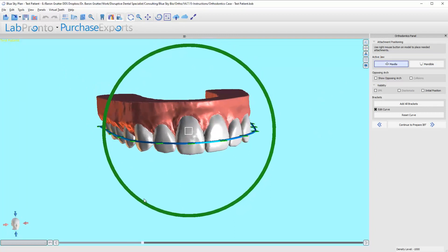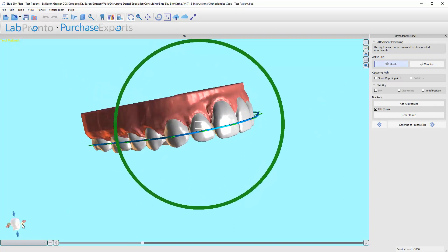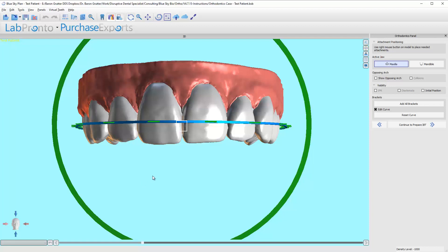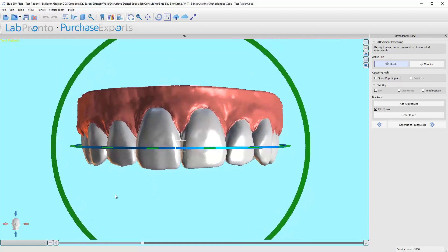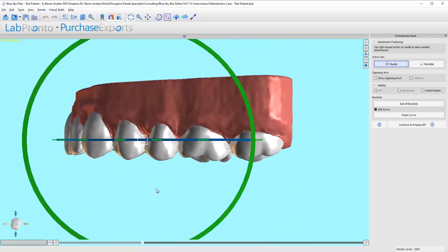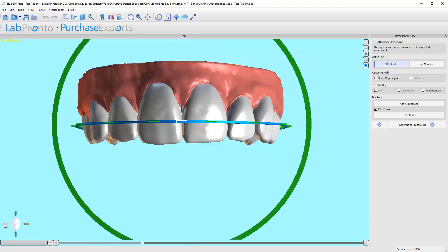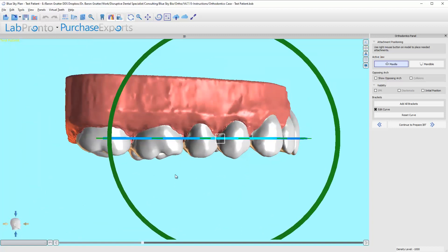So first thing I'm going to do is I'm going to look at the front of the face by clicking the yellow arrow. Looks pretty well centered there. Come to one side, looks pretty darn good to me. Let's swing around to the other side, looks good to me.